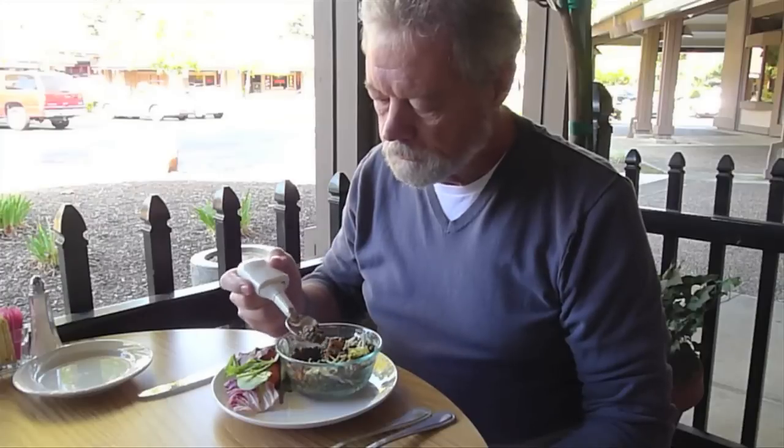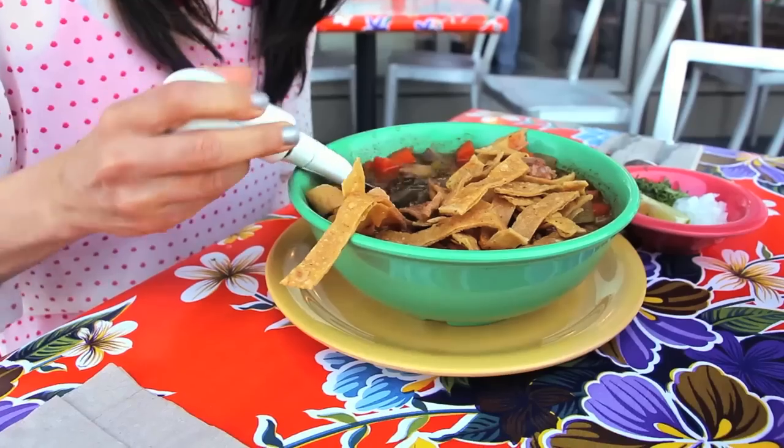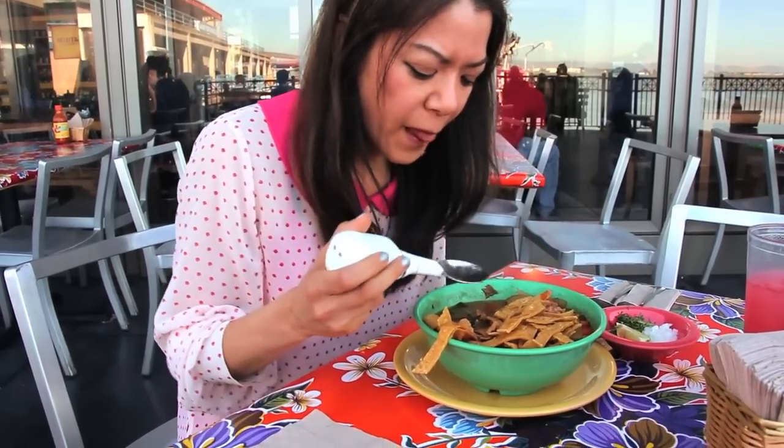We invented the Liftware spoon to cancel hand tremor and take the frustration out of eating. For the first time, we have the technology to actively stabilize a person's tremor in a device so small that it fits in your hand.